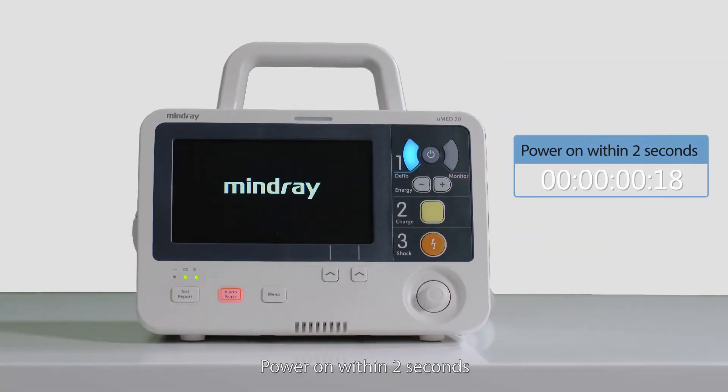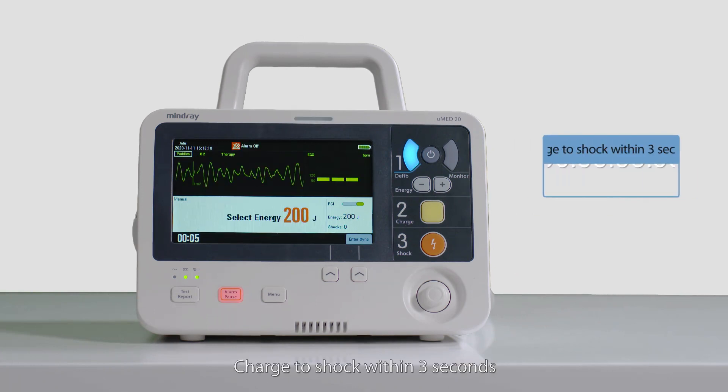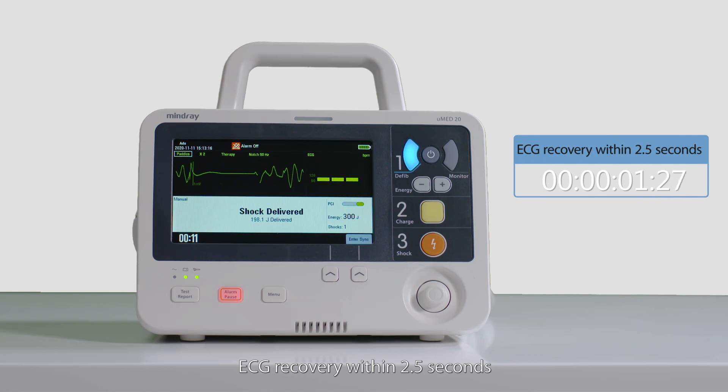Power on within 2 seconds. Charge to shock within 3 seconds. ECG recovery within 2.5 seconds.